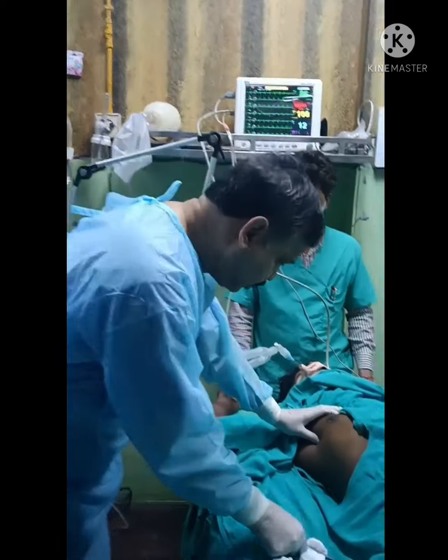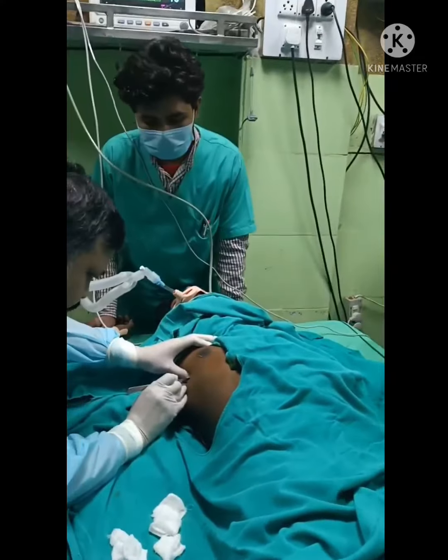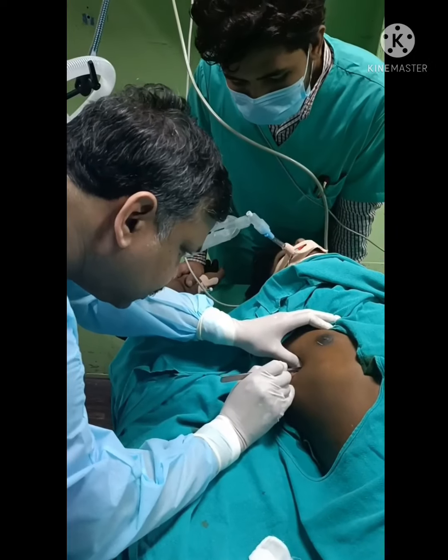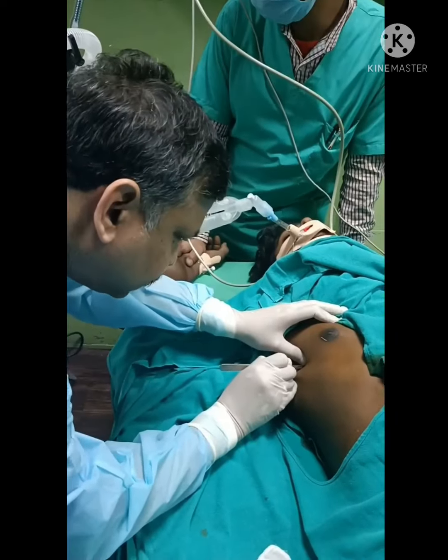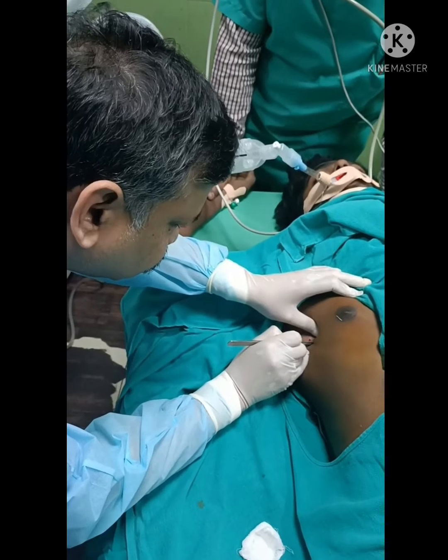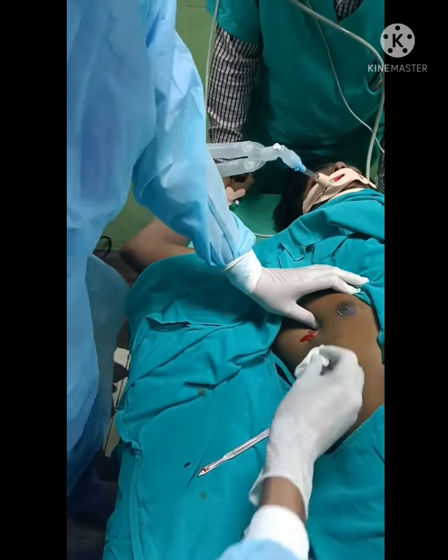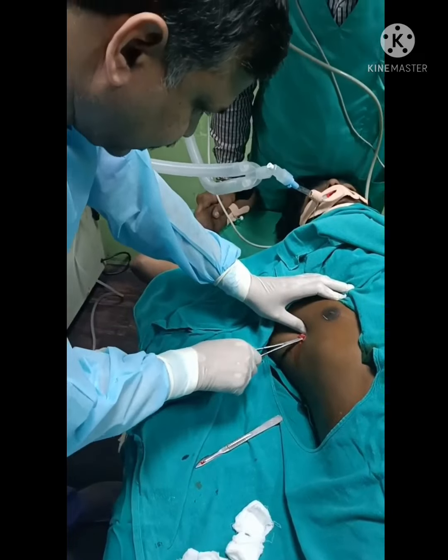Okay, here is the patient, and it has to be the lower border of the, it is the upper border of the lower rib. One inch long incision. Dissect and dilate.